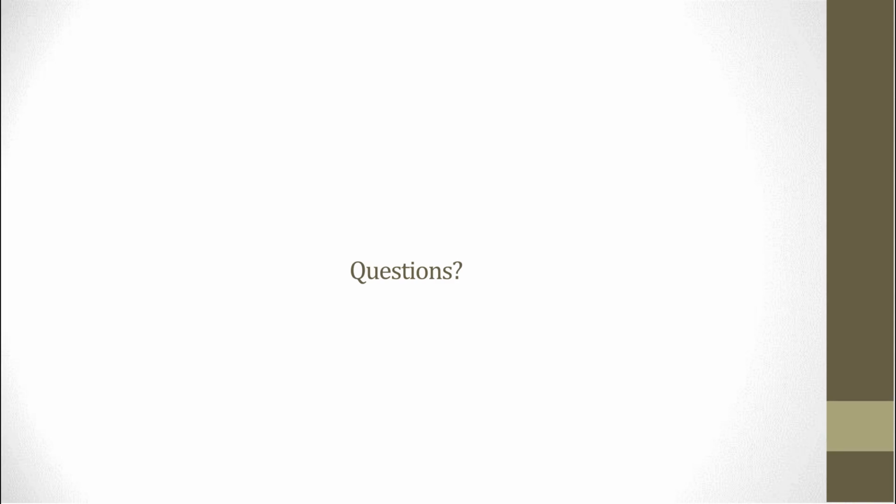Thank you. Next question. Can someone with a basic knowledge of bioinformatics utilize this platform for data analysis with ease? I would say so. Within our laboratory, we have a trained bioinformatician, but for the rest of us, none of us have that classical bioinformatics background. And we found as a team that we're readily able to navigate these platforms and software without needing that in-depth background education. It's a fairly straightforward platform to utilize.